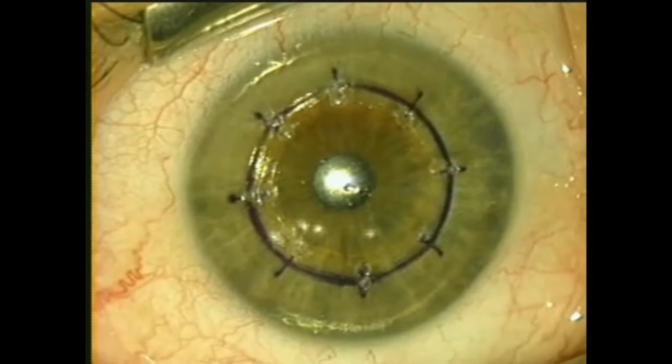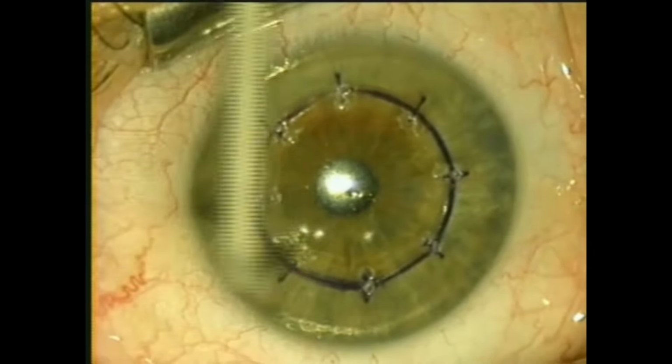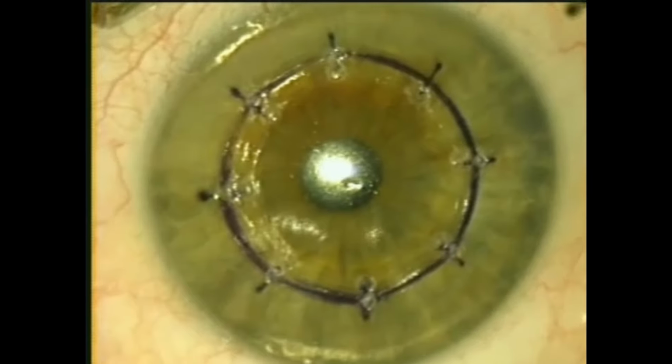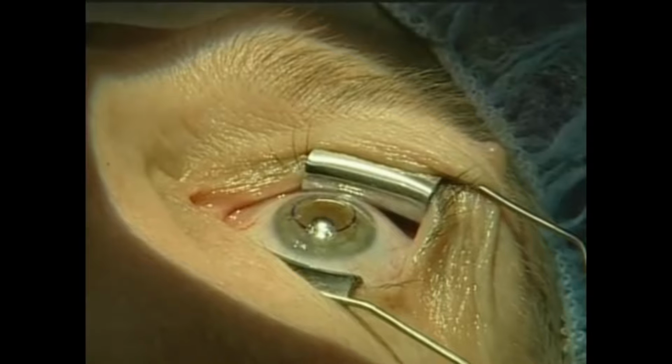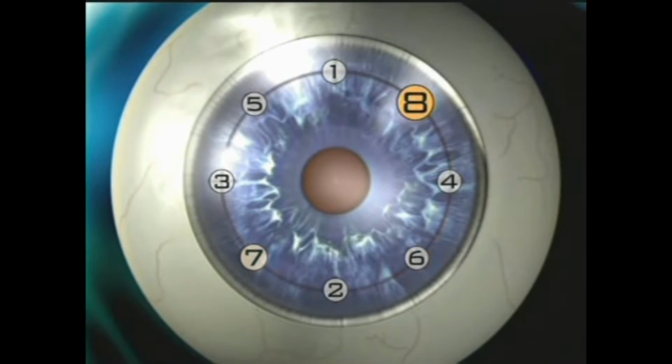And we treat each of the meridians, putting another spot at 7 millimeters. And this is in real time, so it is quite rapid and fast to do the procedure. With a little bit higher magnification, you can see the little striae lines radiating in between. And again, the side view showing the application, a little bit higher magnification here. And that's it. There's 16 shots for a correction of 1.75.